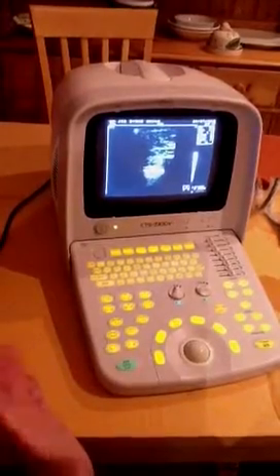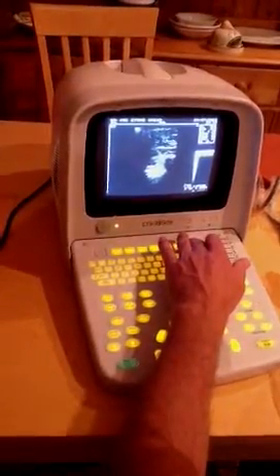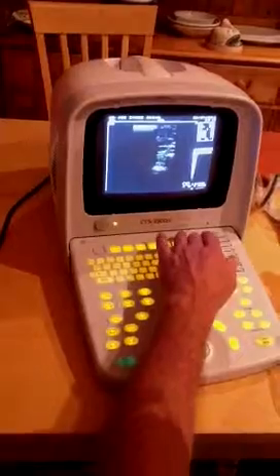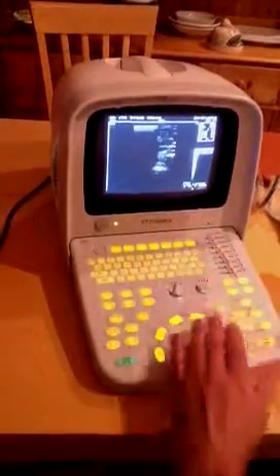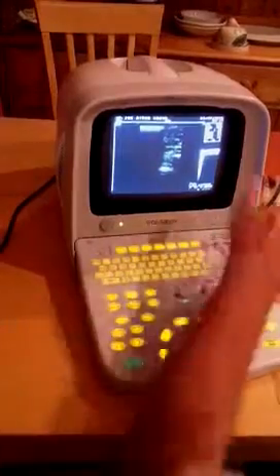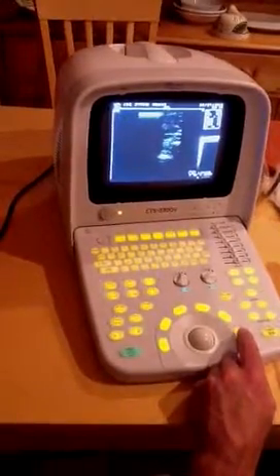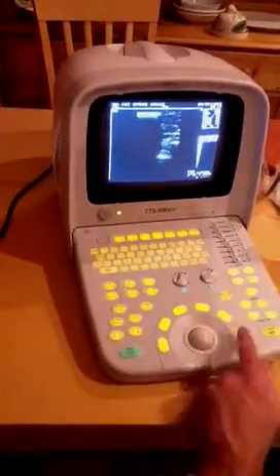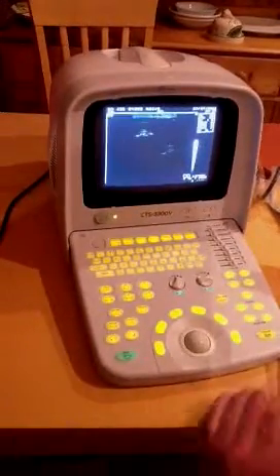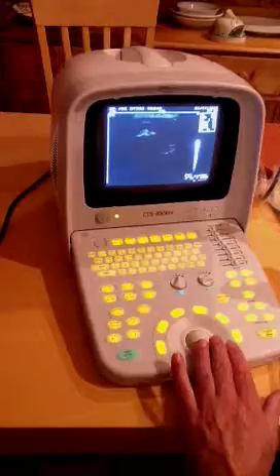If you want to retrieve the cine image made a few minutes ago, you go to freeze and recall. The unit will ask whether you want to recall from the local disc, which is the internal memory of the machine, or from a USB plugged into the back of the unit. We'll select the local disc, press enter, and it's image number one. Press it, and the image appears back on screen — that's the image we actually saved.